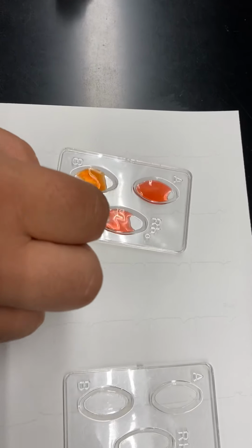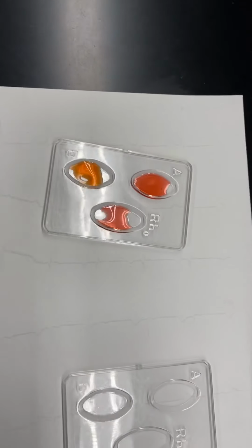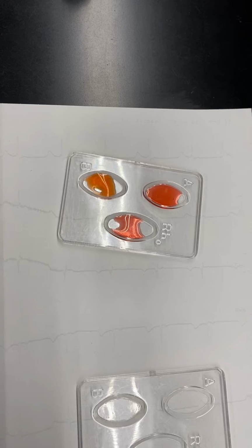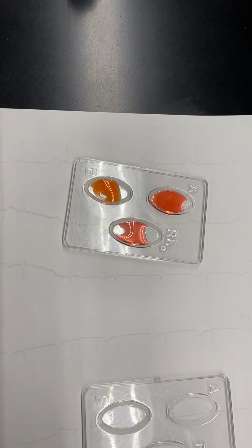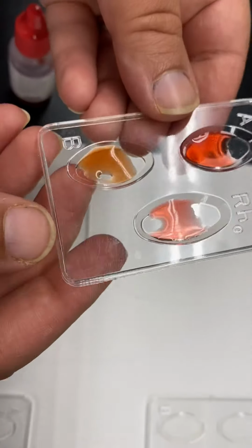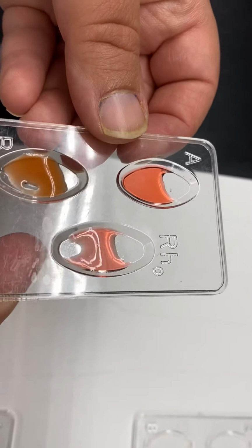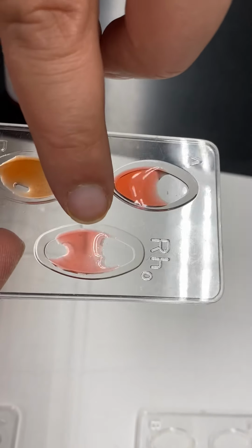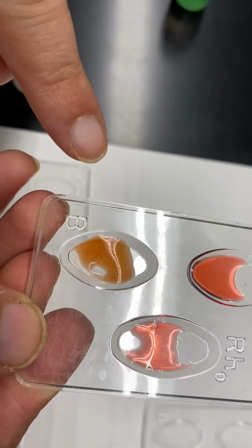In these scenarios, anytime I'm mixing a blood sample, I'm looking for any form of clumping, anything that is different from what I originally started with. If you look at this sample, I don't know how clearly you can see this. You can't see anything in this sample. This is pretty clear still. This is also pretty clear, but notice this one.